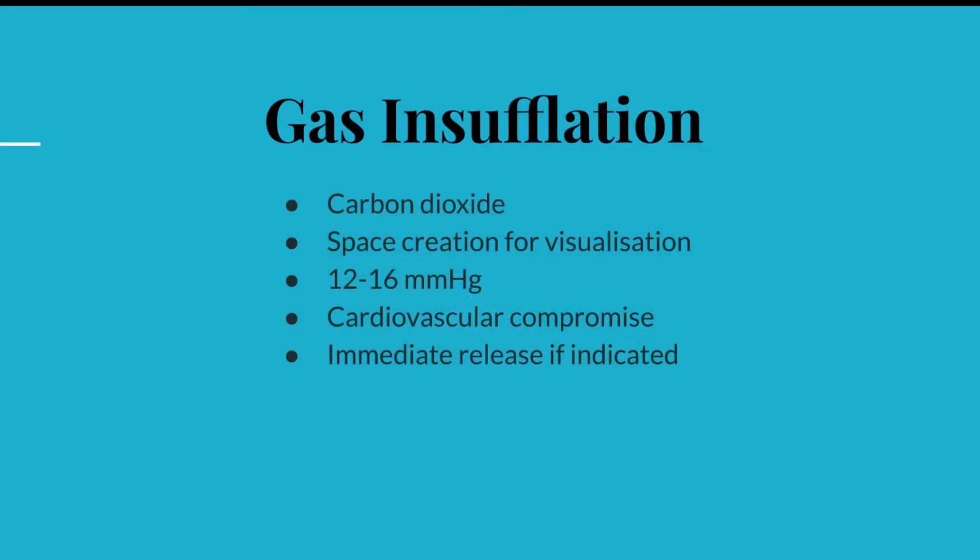After going through a few different methods of gaining abdominal access, we'll now take a look at the stage of gas insufflation in achieving pneumoperitoneum. Pneumoperitoneum is essential to provide sufficient working space intraperitoneally.